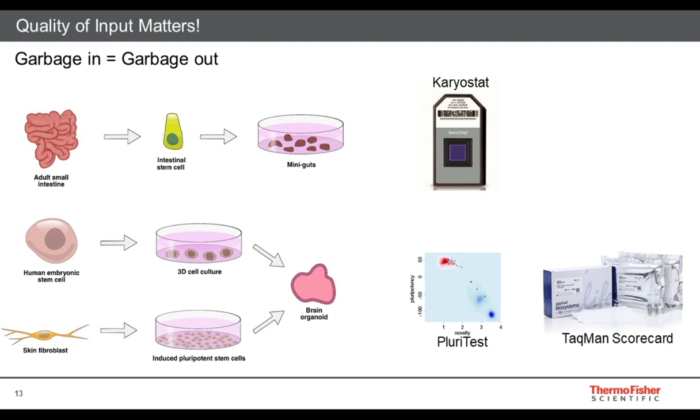So one of the things that's useful to do, shown here across the top, and this applies to pluripotent stem cells as well, which are cartooned on the bottom left: if you're working with stem cells, it is good to periodically characterize the chromosome number or chromosome abnormalities to get a sense for what the genomic stability of your system is, so that there aren't chromosomal abnormalities contributing to aberrant differentiation methods, so that when someone else tries to use a given method on their own cell line, they get different information than what was published. So it's really important to characterize the genomic stability of your cells.